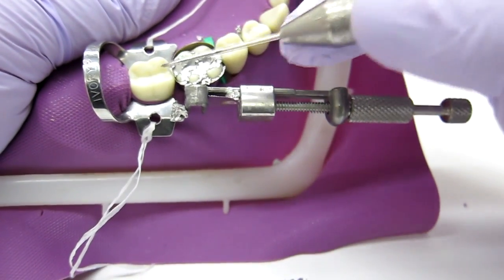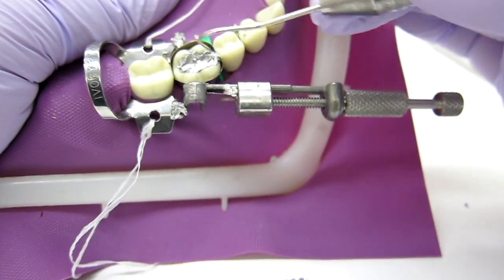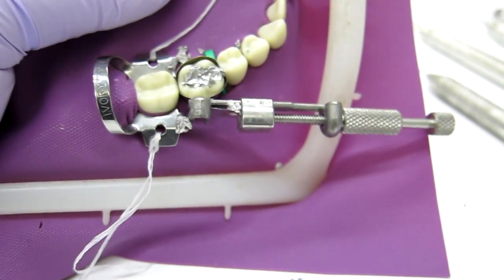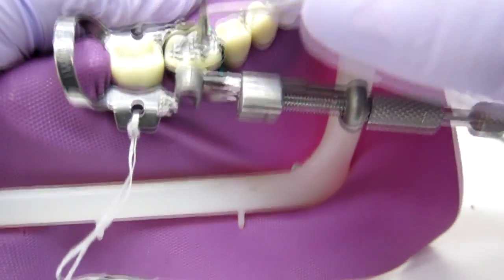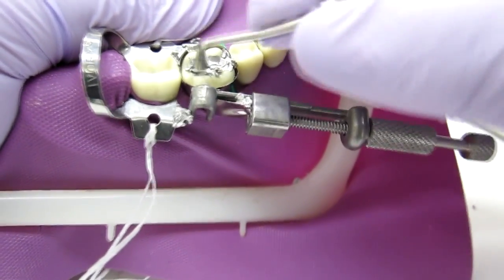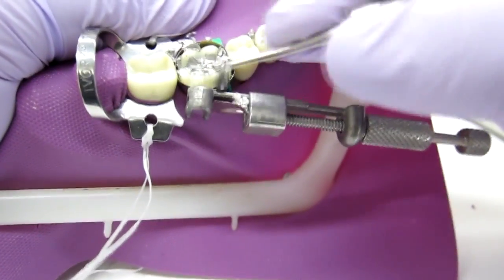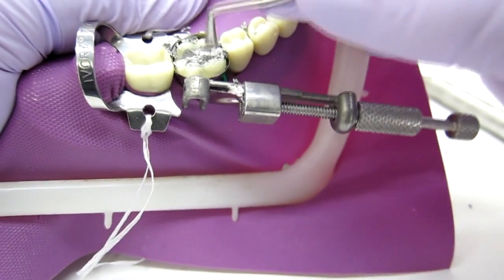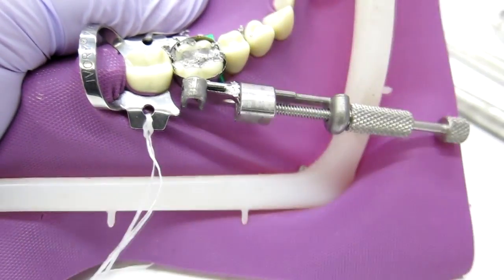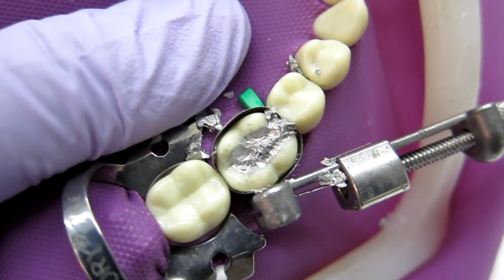I'm going to take an explorer and clear all the amalgam from the edges so it's not stuck to your band. You want to clear the amalgam from the band, and this is where I like using a burnisher on the edges right where the amalgam meets the tooth, so you get a nice seal. I'm going back and forth between tooth structure and the amalgam, moving mostly in one direction when crossing, keeping mostly on tooth structure so you don't create unnecessary grooves.